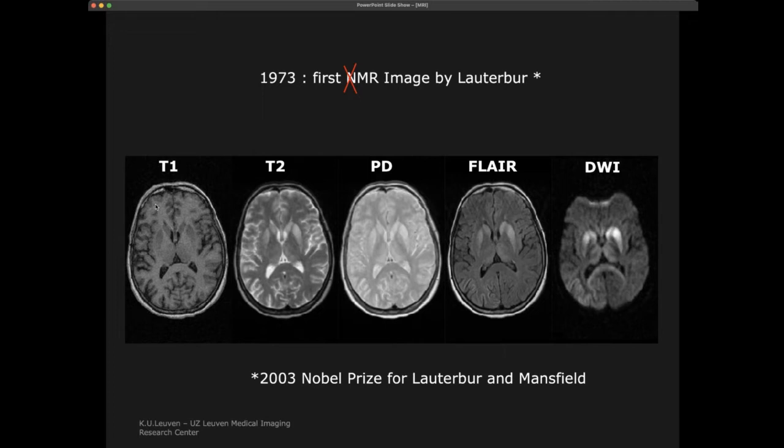What is important is that a magnetic resonance scanner is a flexible device with which we can produce different types of images. But that also makes it more challenging. In order to operate a CT scanner, it's reasonably simple. You have just a few settings, which depend maybe on the size and the body weight of the patient and the part that we want to image. An operator, who is mostly a radiology technician, doesn't need to put in a lot of settings. When you look at an MRI scanner, it's more like a cockpit, because there are a lot of parameters that you have to tune. And so magnetic resonance requires a lot of expertise just to make the images.